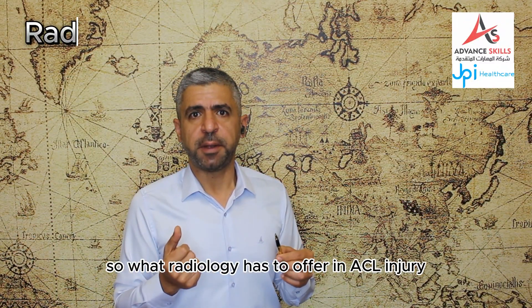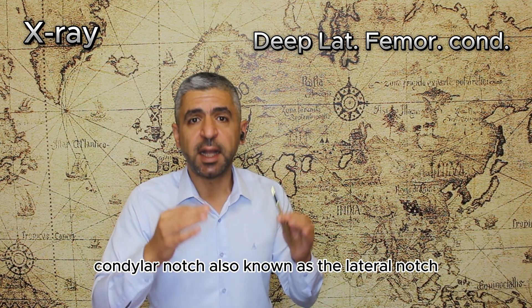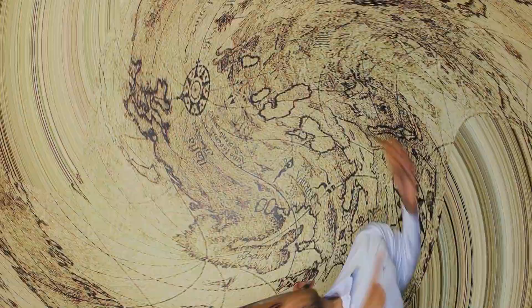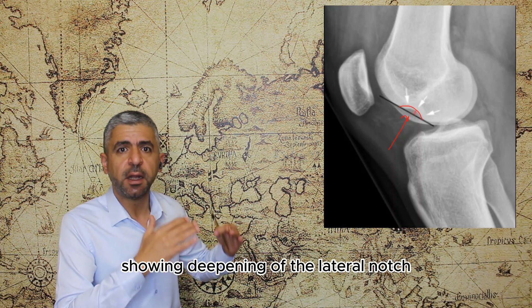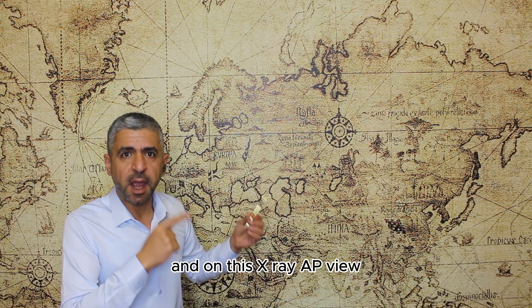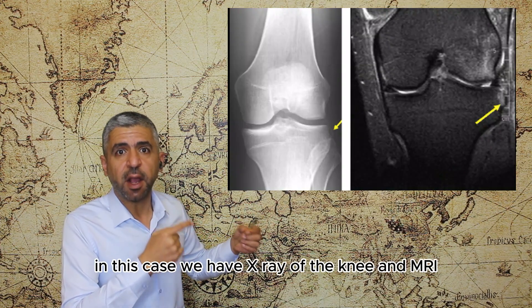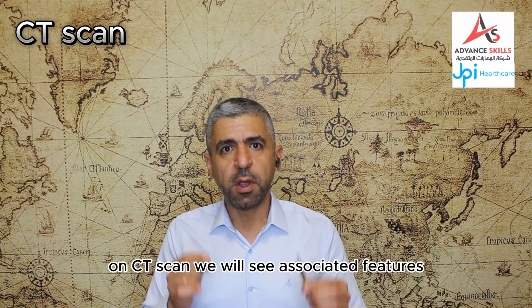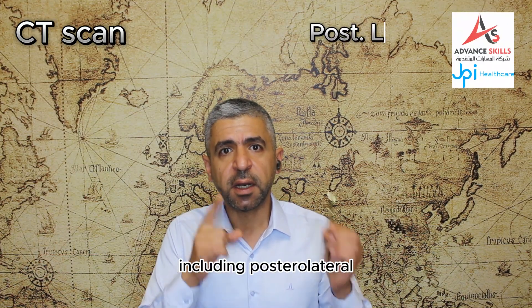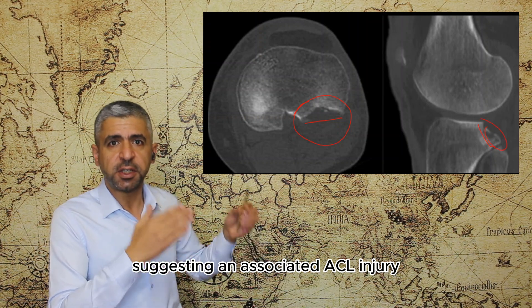On plain radiography, findings include deepening of the lateral femoral condylar notch, known as the lateral notch sign, and Segond fracture. On this x-ray the lateral notch appears deepened suggesting ACL injury. Another x-ray also shows the lateral notch sign. On AP view, a Segond fracture is seen as an associated finding. A case with both x-ray and MRI demonstrates the Segond fracture on both modalities. On CT scan, associated features include posterolateral and posteromedial tibial fractures.